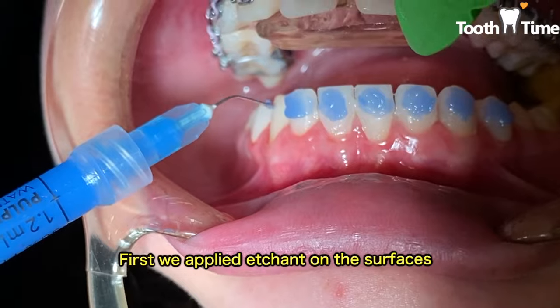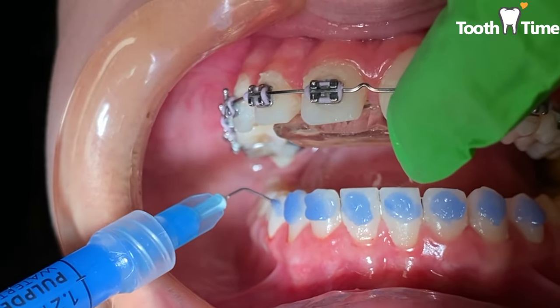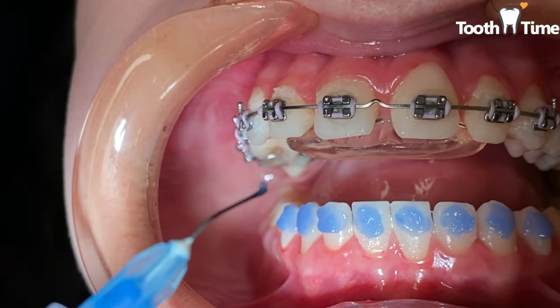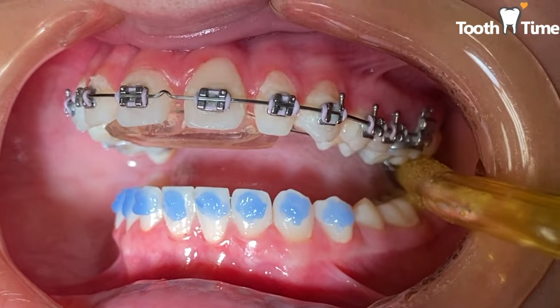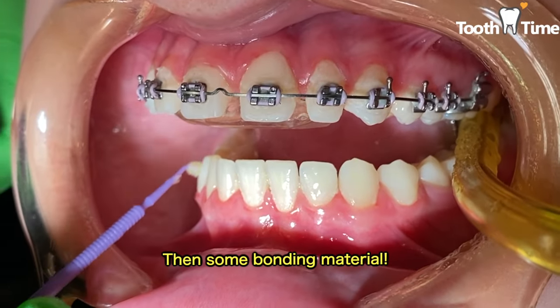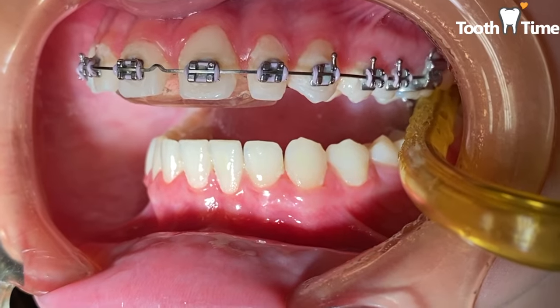So one of the reasons why we wait is because right now what we want to do is just focus on expanding the palate, or the lower, and then just align as we go within the next few months. And also your bite is too deep, so it's going to knock off some of the braces. So that's why we wait a few months.